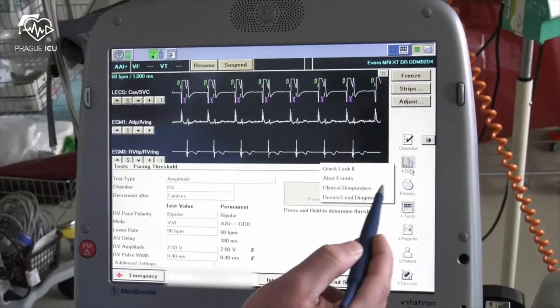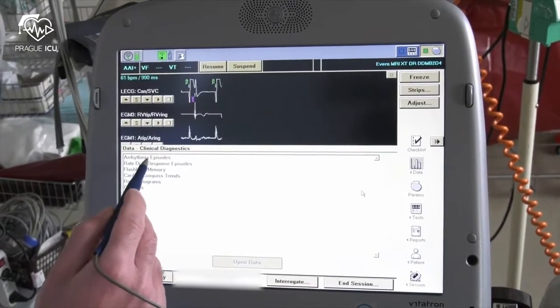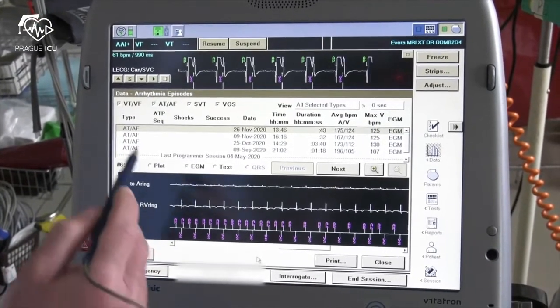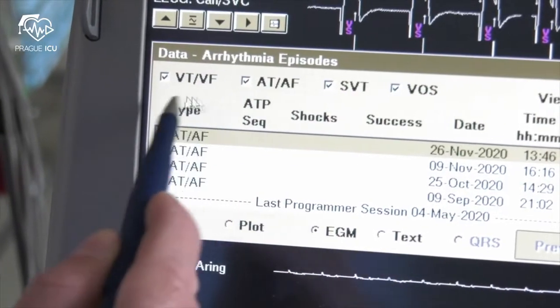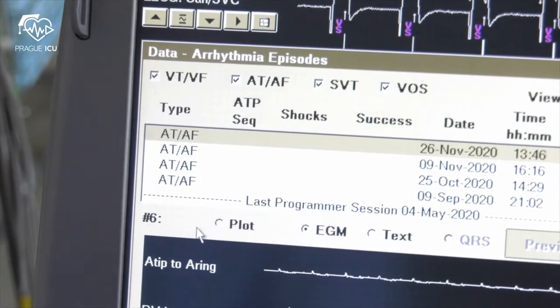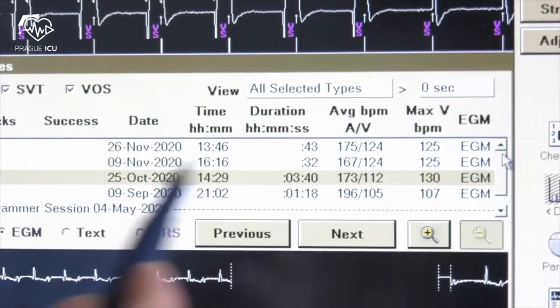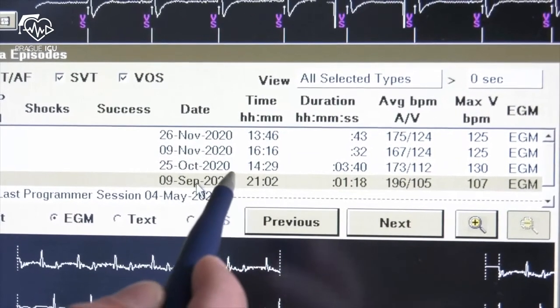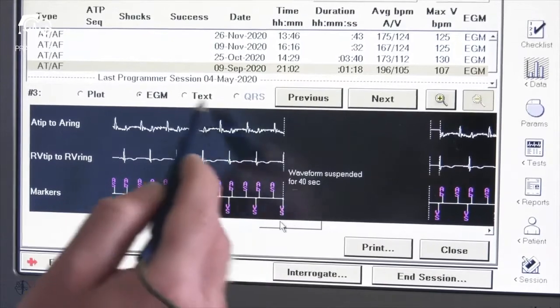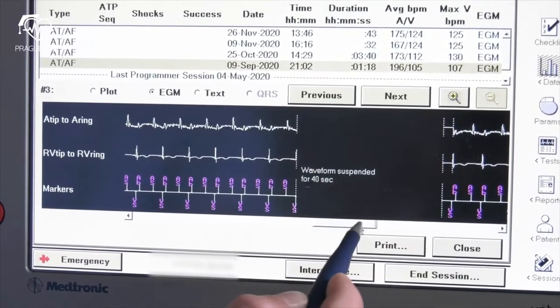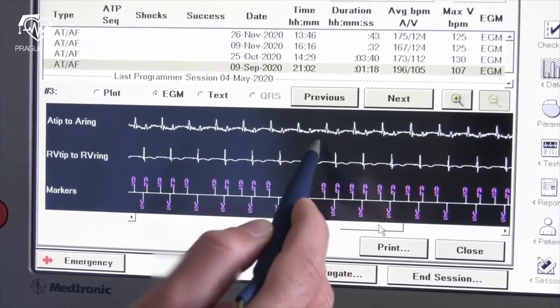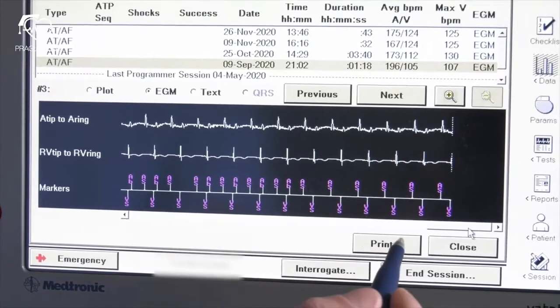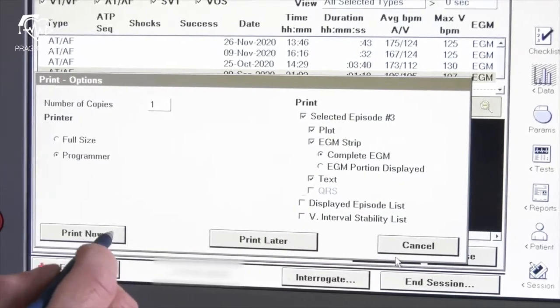To check a history of arrhythmias click on the data icon and choose clinical diagnostics, then arrhythmia episodes and open data. Subsequently a new window with arrhythmia episodes will appear. In this window you can see recorded episodes with different types of arrhythmias if there are any. In this scenario you can see four episodes detected by the device as AT/AF with date, time and duration. By clicking on the EGM node for each episode you can assess each arrhythmia in detail, then you can print out selected episodes.